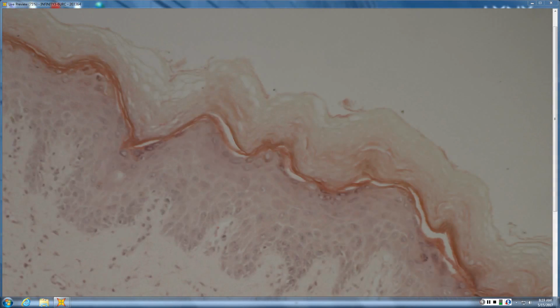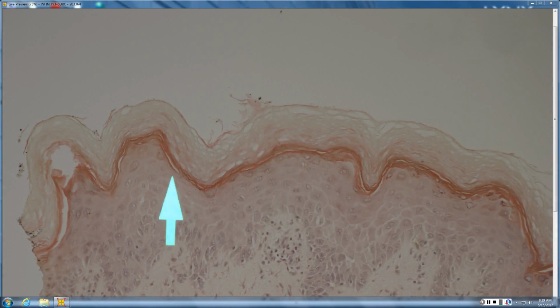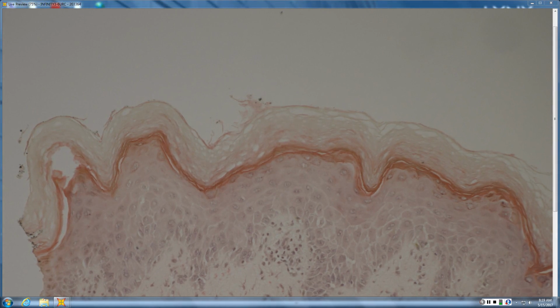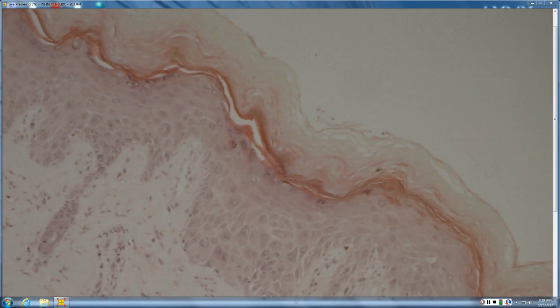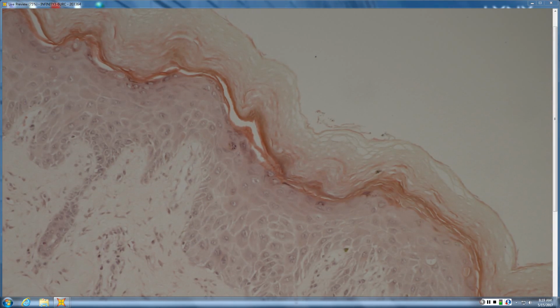And when you look at your epithelium, cells stay round pretty much towards the top. They don't flatten out normally. So you're on acral skin, you've got a little bit of interface dermatitis, a little abnormal maturation, not much inflammation, and it's someone with very sore, red to violaceous hands, undergoing chemo. Patient over at Hollings.